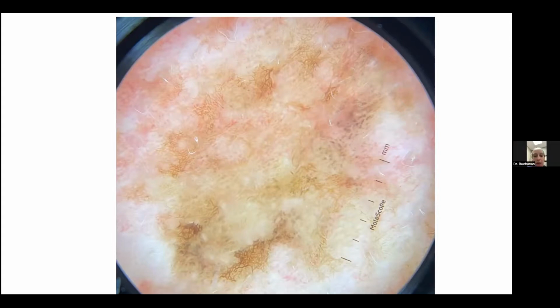Agree. It looks like some atypical dots, granules kind of at the periphery there. Some pink, white areas. Maybe some fingerprinting in the periphery, which can sometimes be seen with a lentigo-like pattern. But overall, I think asymmetric with the atypical pigment network and gray dots granules is concerning. Excellent. Lots of colors and ways of describing just the physical characteristics, using common language. It always surprises me when we try and make something harder than it really is.